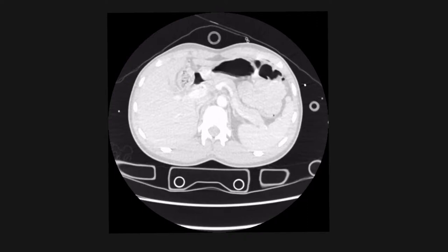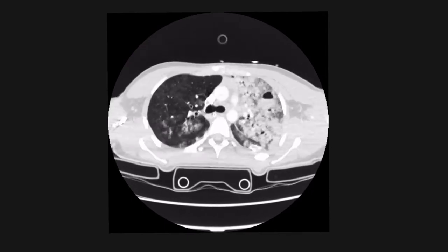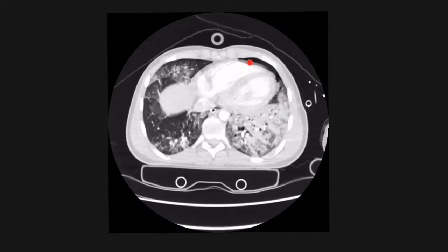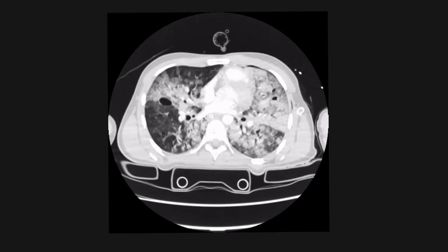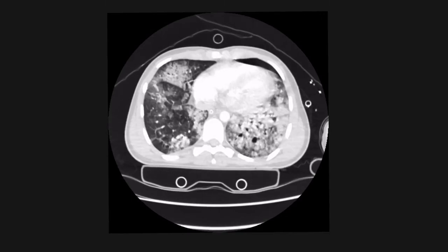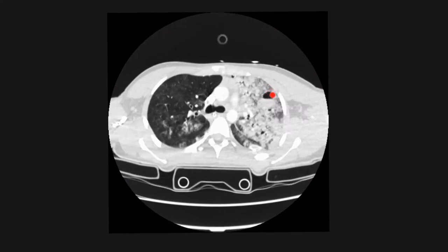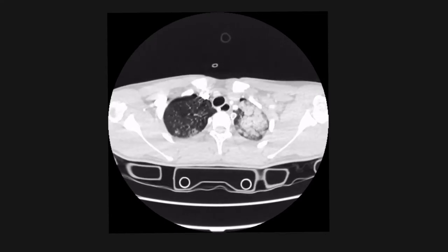This CT is from a patient who presented as a major trauma call — they came off their motorbike at 60 miles per hour and were GCS 3. There are multiple abnormalities bilaterally: a pneumothorax on the left side, areas of consolidation worse in the left lung but also seen in the right lung representing contusions, and cystic areas again worse in the left lung in keeping with traumatic pneumatoceles. The patient also had multiple fractures seen on bone windows.